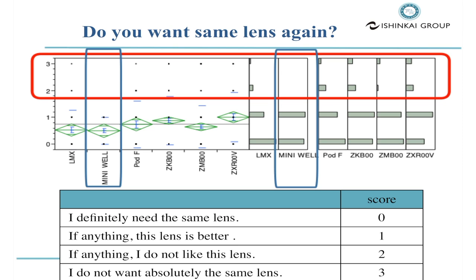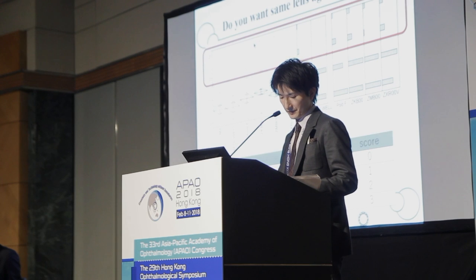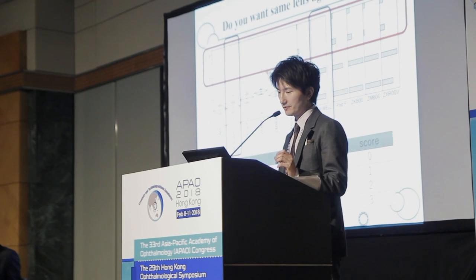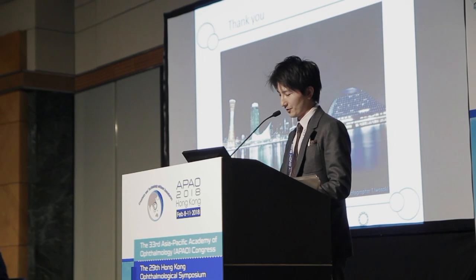And there was no MiniWell patient who would decline using the same lens again by giving a score of 2 or 3. But with another multifocal IOL, there are some patients with a score of 2 or 3. So this shows that the patients are highly satisfied with the MiniWell. So that's all. Thank you for listening.